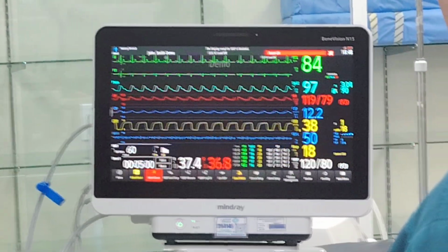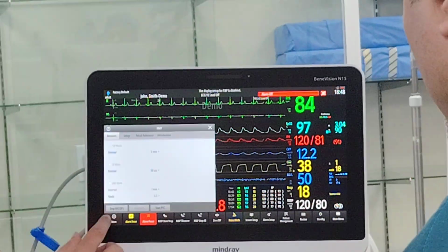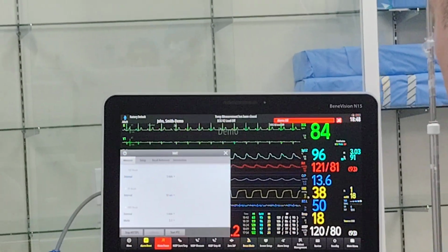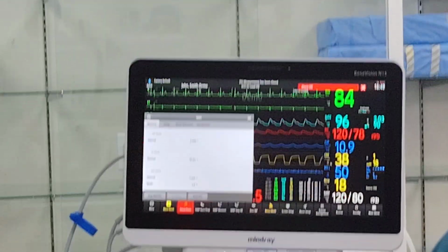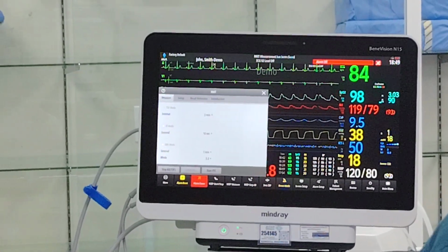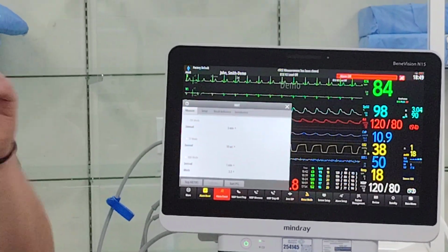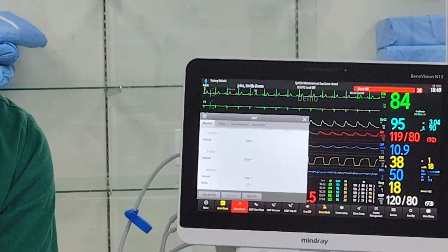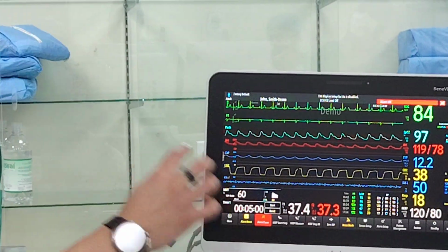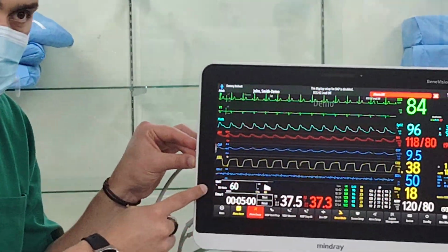All right, now what I did, please note, I pressed start. Don't press start, press calibrate. The first time is always calibrate. When you do the calibrate, it will do one shot. You will hear teet, teet, teet, teet. Then it will do another one. The first one is a reference, and the second one is the actual measurement from here.